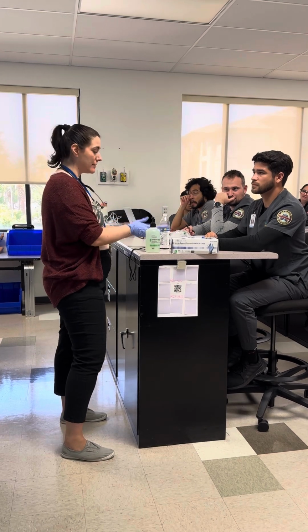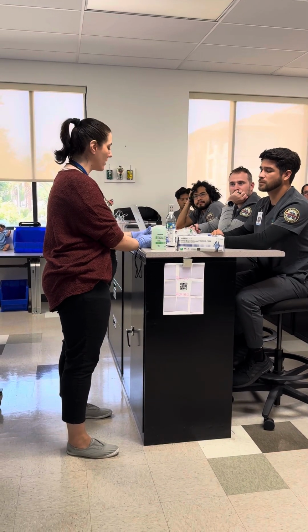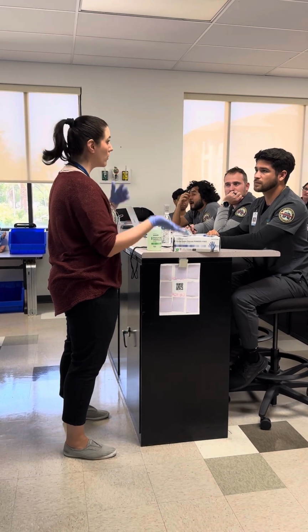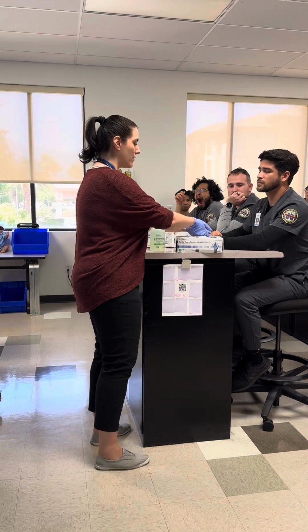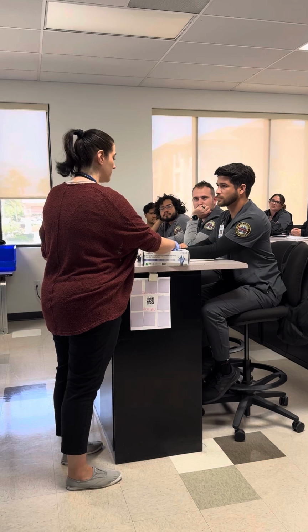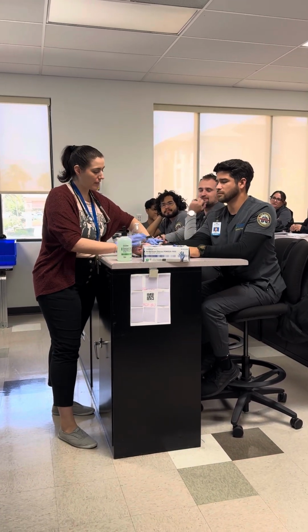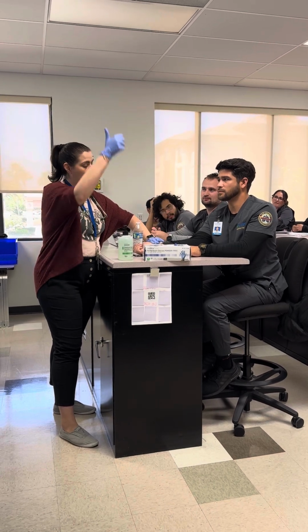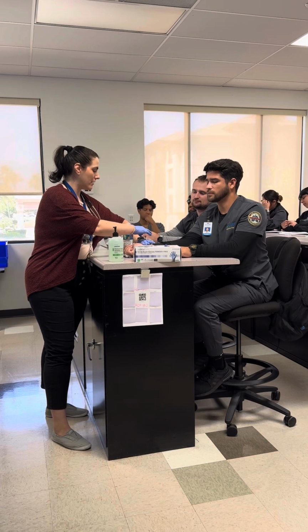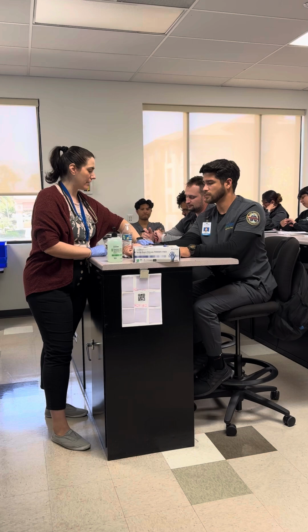But it's your intent to now read the pulse oximeter and remember that the pulse ox is demonstrating information that you don't necessarily trust. So at this point, I want to make sure that you are correlating the information on the pulse ox. So I'll have the patient flip their wrist over so I can get a manual pulse check. So I'll find the pulse. I'll try the other hand since your watch is on. Find pulse at the same line as the thumb. And then at that point, once you find pulse, I would recommend having your timekeeping device on and count or find a space to monitor that 15-second interval.